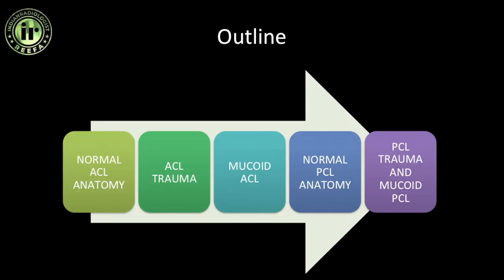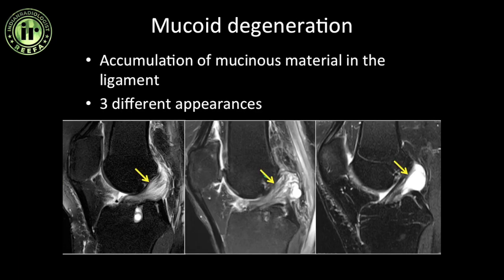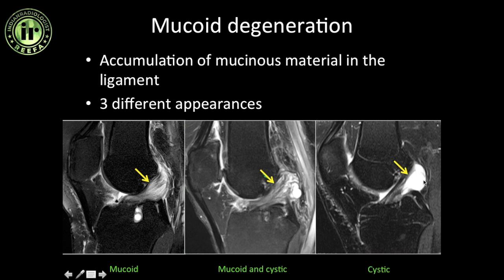Now let us look at the mucoid degeneration of the anterior cruciate ligament. In mucoid degeneration there is accumulation of mucinous material within the ligament, and as a result the ligament can have three different appearances: one is a predominantly mucoid ACL where the ligament is hyperintense and bulky; the second is mucoid ACL along with cystic degeneration or a ganglion cyst forming at the femoral attachment; and the third is a predominantly cystic type where there is a large ganglion cyst at the femoral attachment but the ligament fibers themselves do not show much degeneration.